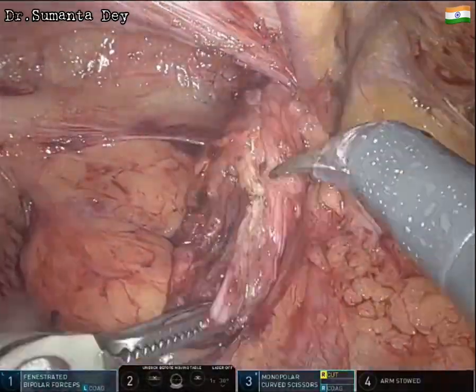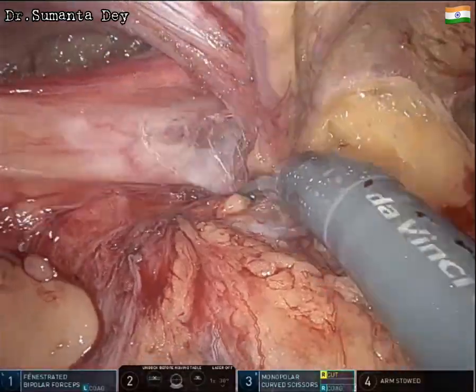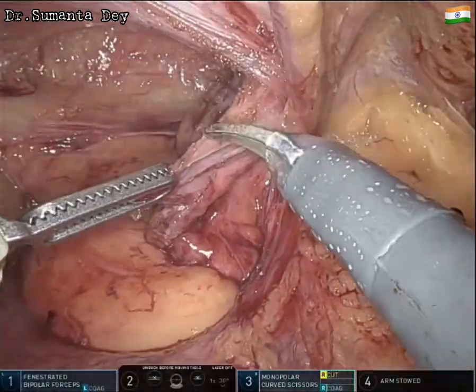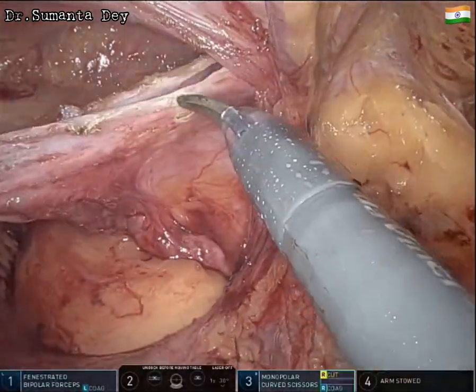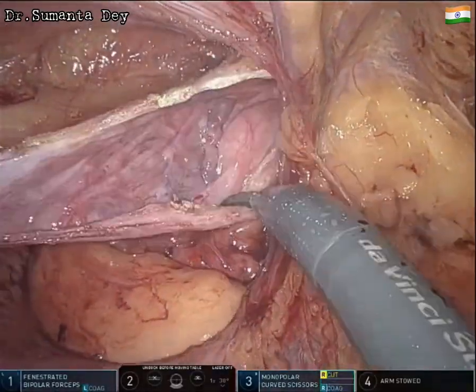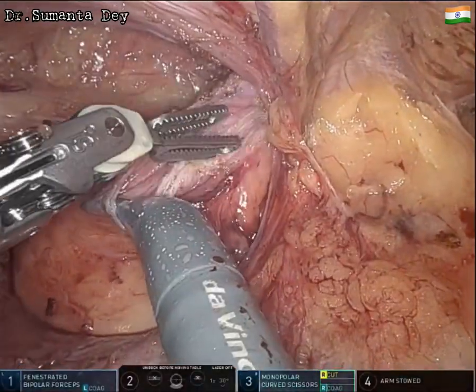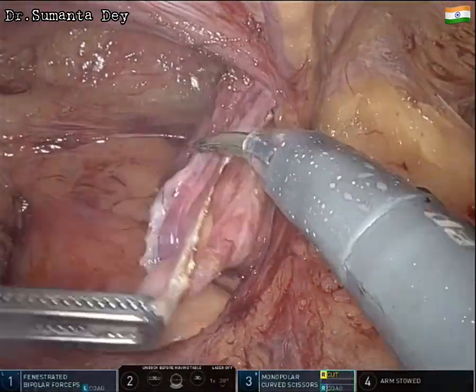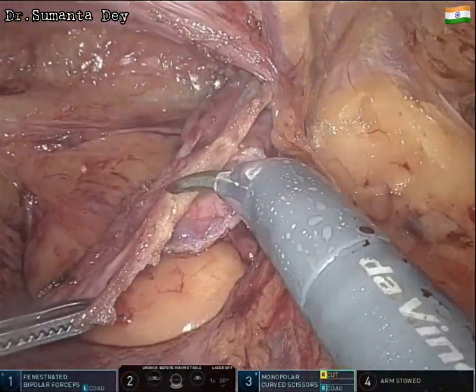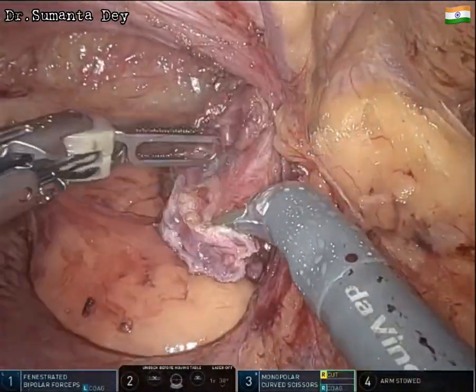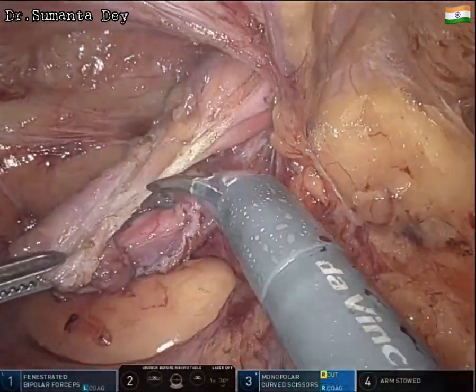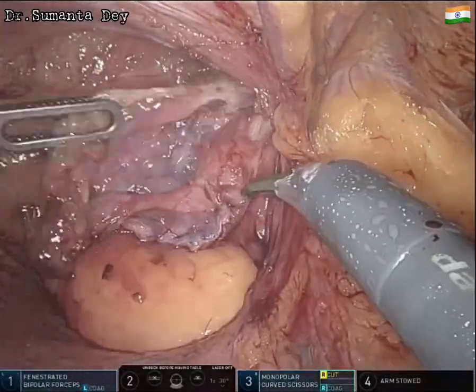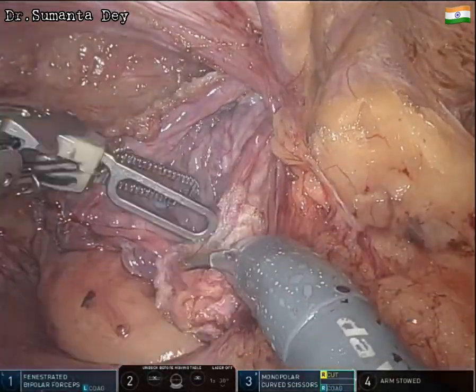The testis and cord structures are swung away, and the medial aspect of the sac is cleared. The sac is opened at the distal margin and divided. Medially, the vas deferens will be encountered; the gonadal vessels are already separated laterally. The division is carried out carefully so the vas deferens is preserved, sweeping it away as the sac is divided all around. A small remnant of the sac will stay along with the testis in the scrotum.